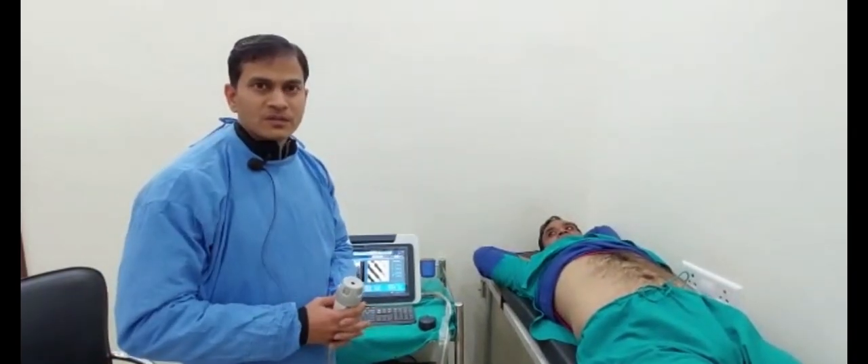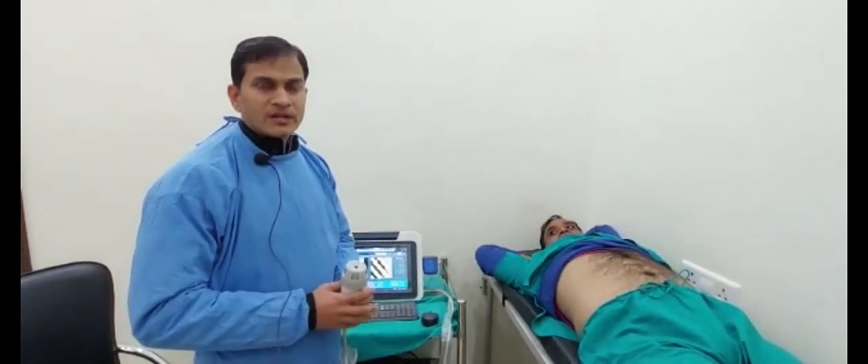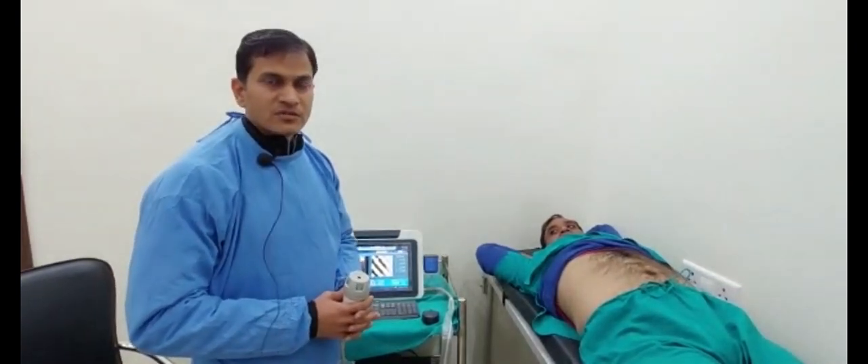Hi, myself Dr. Kapil Gupta, consultant at GastroCare Hospital, Kota. Today I am sharing my experience with the liver elastography machine.